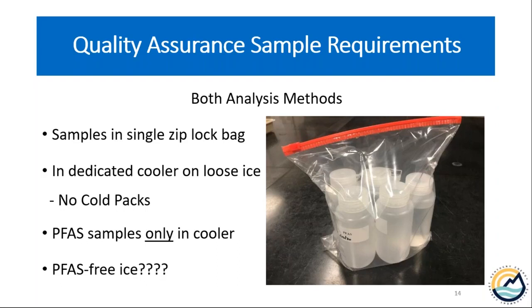And you'll see at the bottom, I put PFAS-free ice with several question marks. Our SOP recommends the use of PFAS-free ice. We've also reviewed SOPs for other labs, which make the same recommendation. However, if we go back to the results of our 2019 drinking water study, we know that there are many places that have PFAS in their finished water. And in fact, Frankfurt was one of those sites.